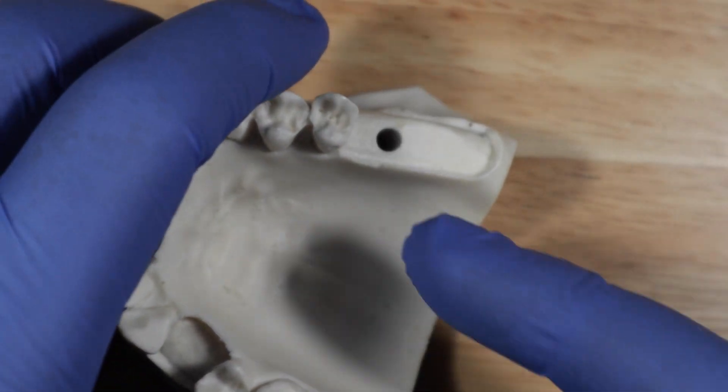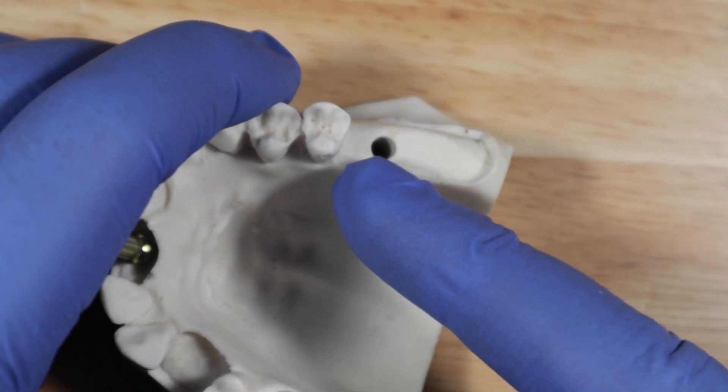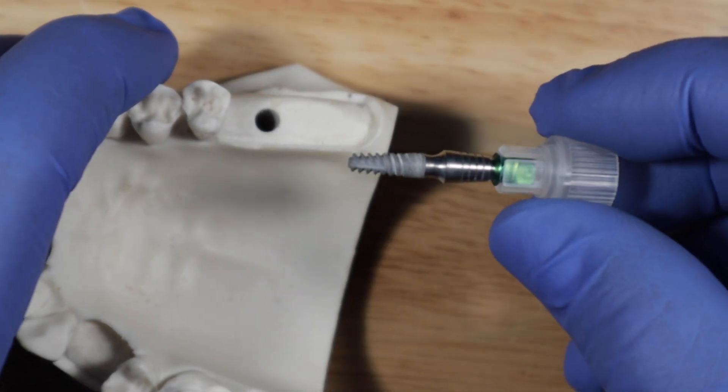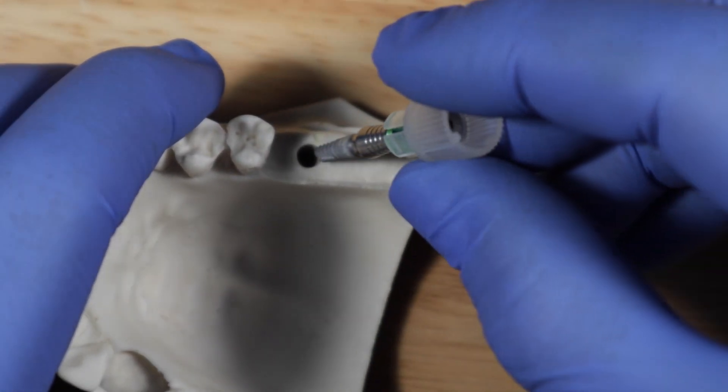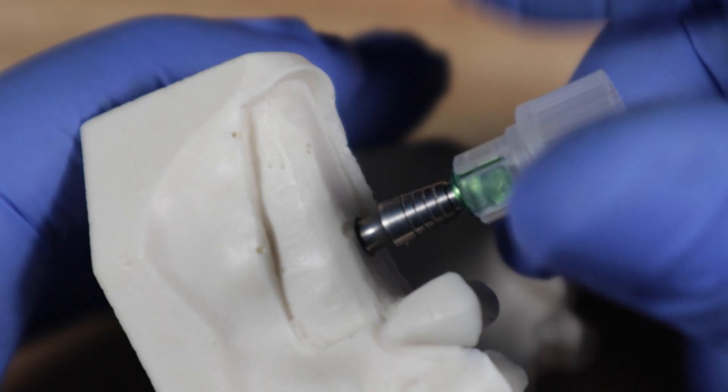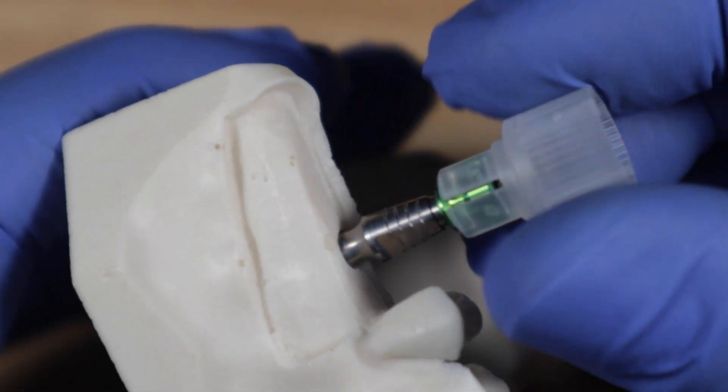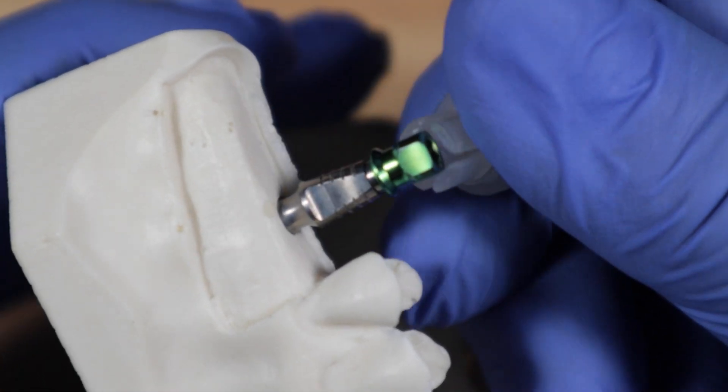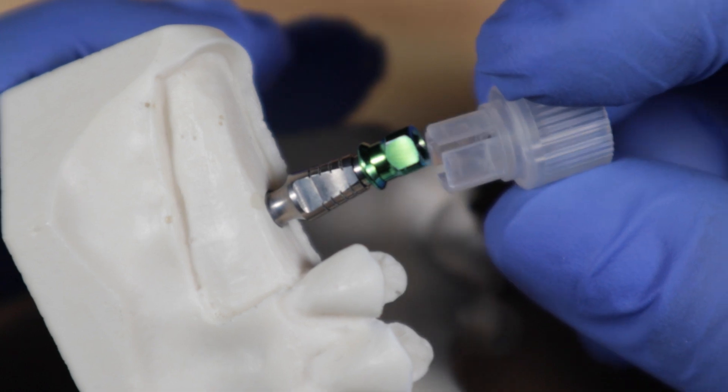And once the site is done, once you've actually prepared the site in the patient's mouth, all you do is grab it from this thumb grip. And you insert that and you start turning this. And this little plastic part comes off, so you can just take it right off. Once the implant gets primary stability, this comes off.